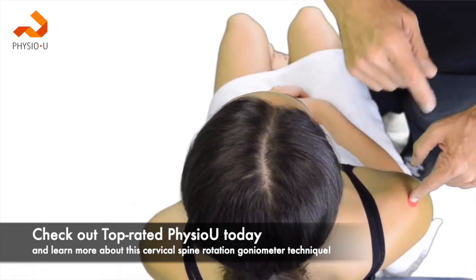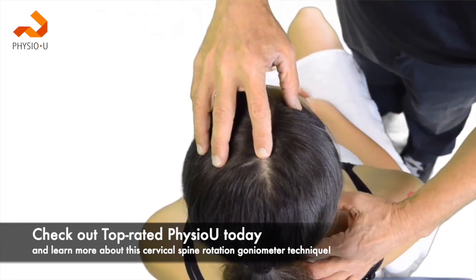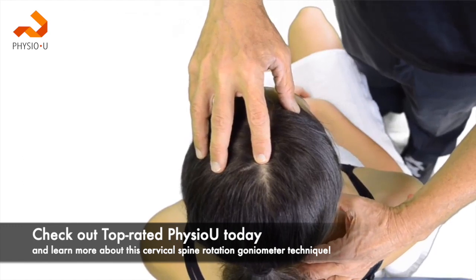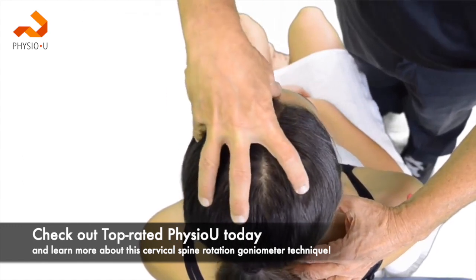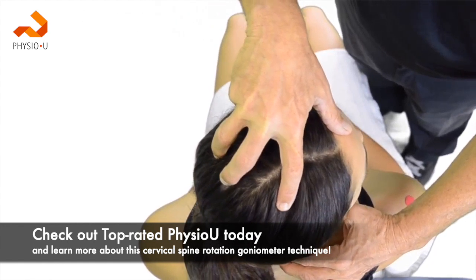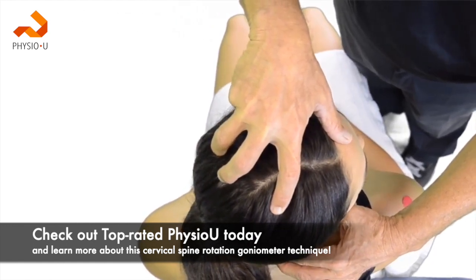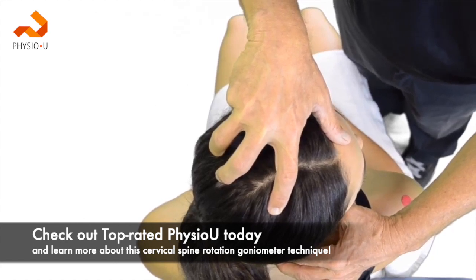Those landmarks should be consistent. We're going to come back and palpate at the C7-T1 spinous process, then have the patient rotate until motion at T1 is detected, which would indicate the end of available cervical rotation.